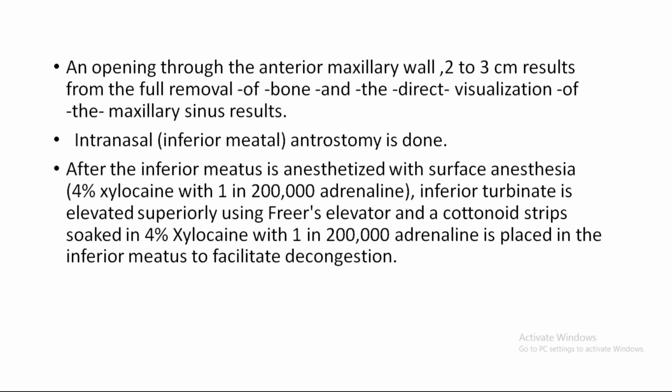The opening is made in such a way that it is flush with the floor of the nasal cavity. The lower end of the opening is at the level of the floor of the nasal cavity. So you have to make the opening in such a way that the lower end of the opening corresponds to the level of the nasal floor.